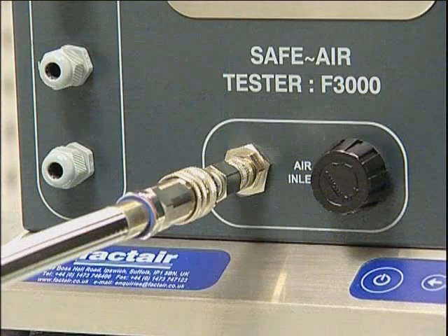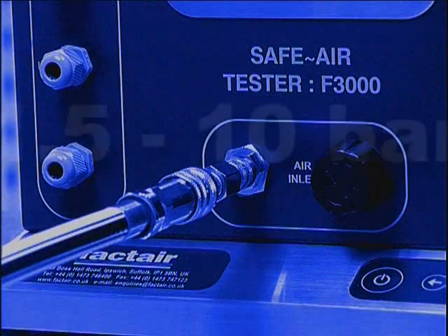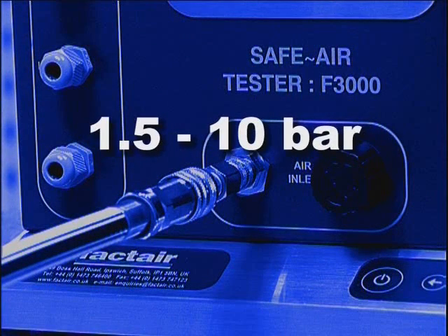Please note that a test can be carried out at any pressure between 1.5 and 10 bar. If the unit is over-pressurised it will automatically shut down and display an over pressure warning. It will then need to be returned to the manufacturer for checking and resetting.